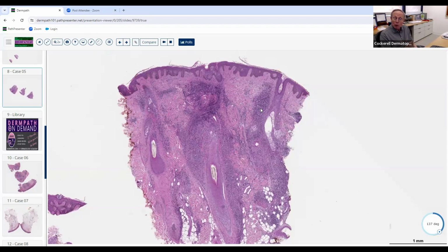You can see lichenoid lupus erythematosus on the skin that can look a lot like lichen planus also. So just realize that there can be overlap sometimes between those two. I don't like lichen planus here nearly as much because look how deep the inflammation is going. And lichen planus just likes this area right here. It's like it's just got a love affair with the isthmus of the hair follicle. That's where the inflammation of LP goes.